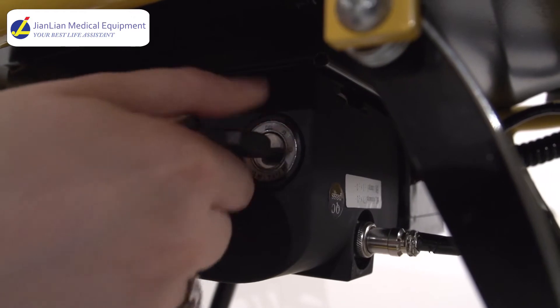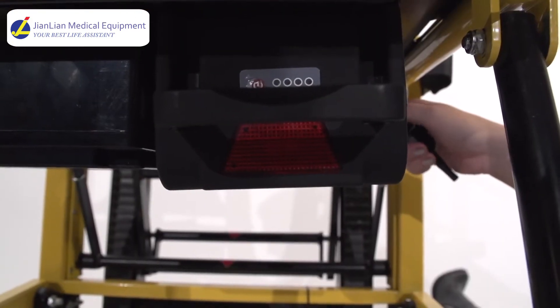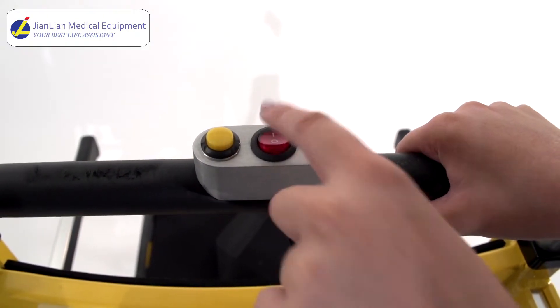Insert the key on the side of the battery and turn it right. The indicator light will illuminate. Turn on the machine by flipping the red switch on top of the handlebar.